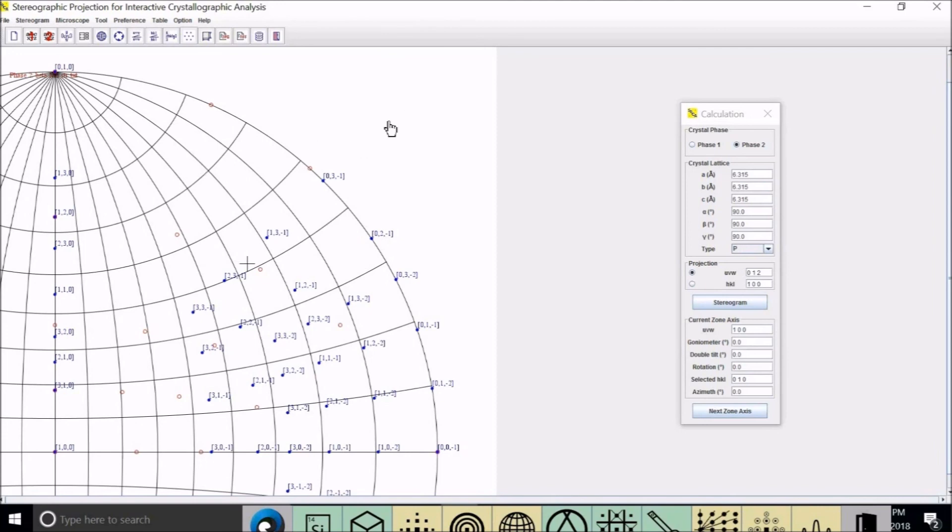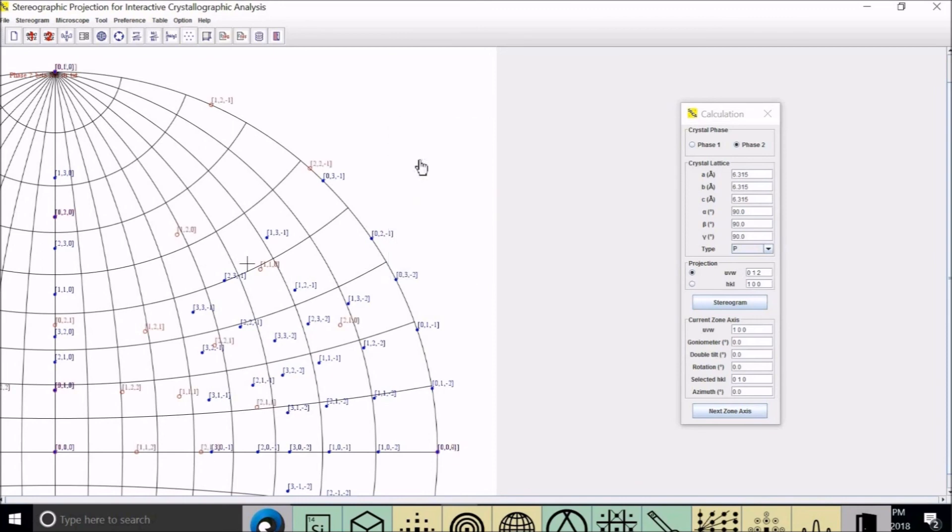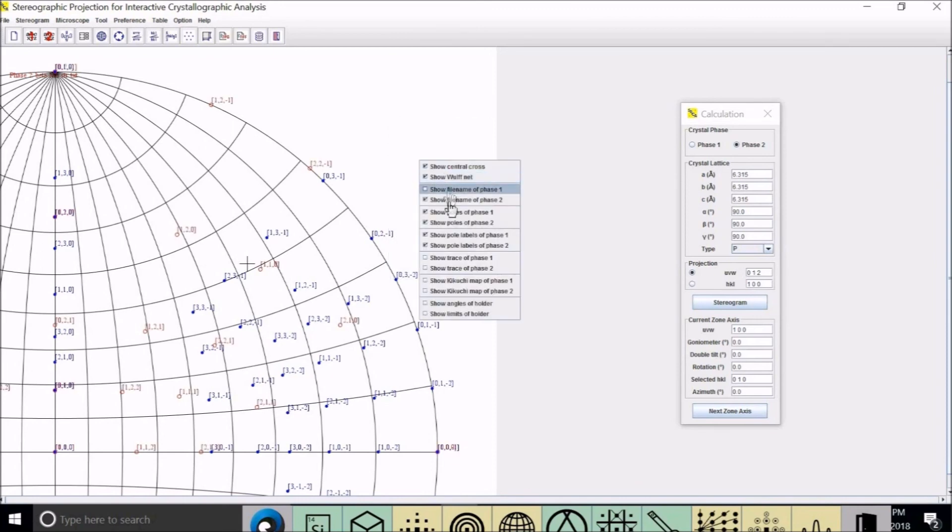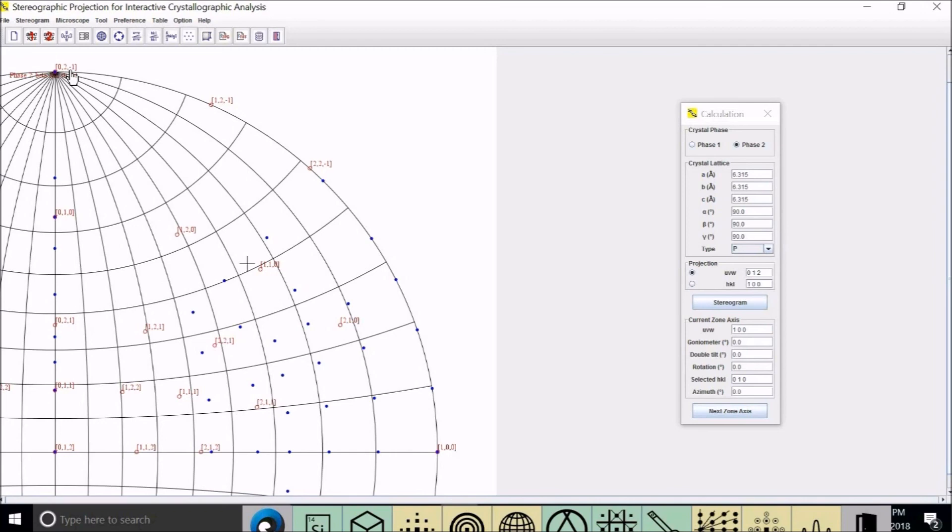You can take one picture like this showing phase one indices. And the second picture, you label phase two and hide phase one index. So now you see 0, 1, 2, and 0, 1, 1, and 0, 0, minus 1, and 1, 0, 0.